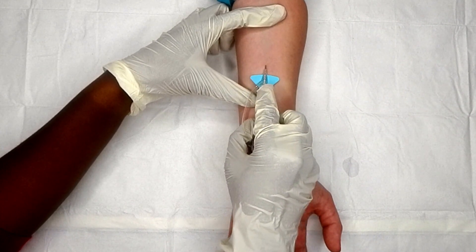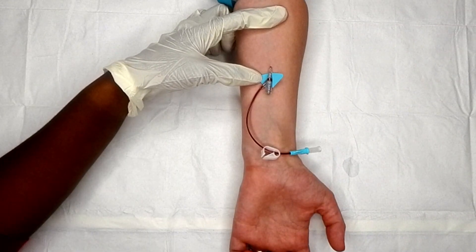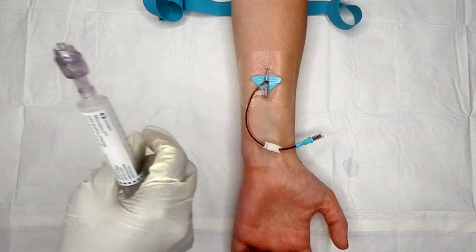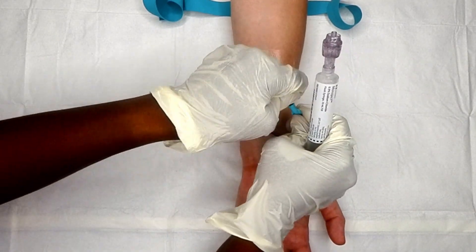I insert at a low angle and get just enough of the catheter inside the vein, remove the needle, and just like that the catheter is in.